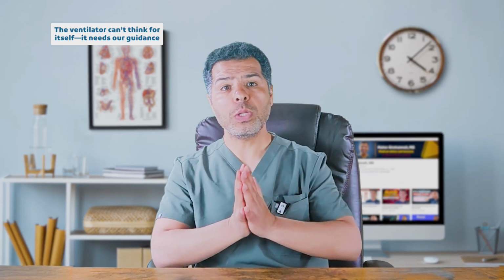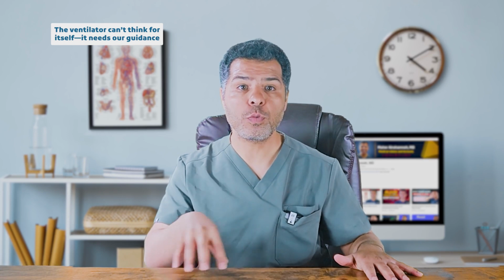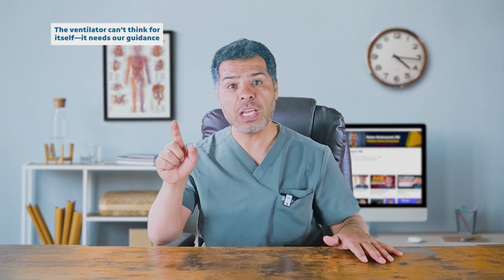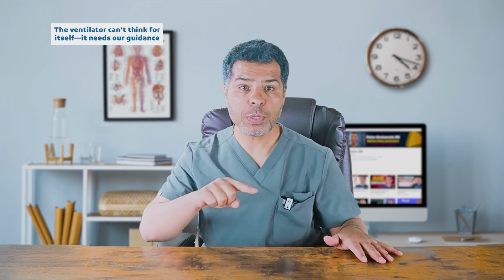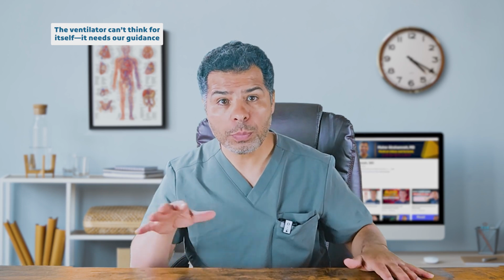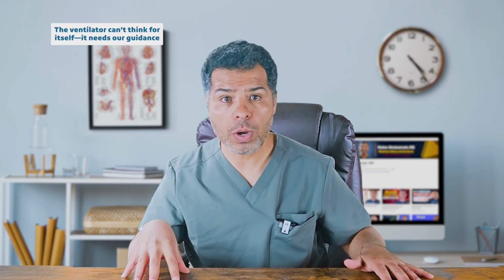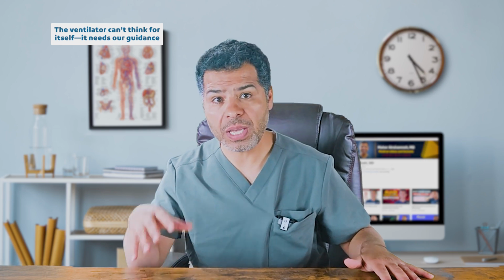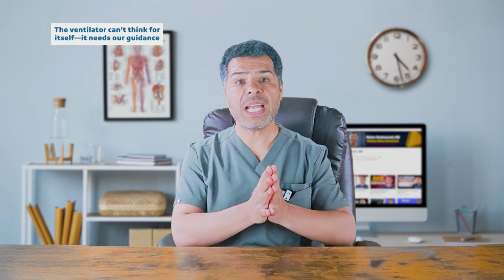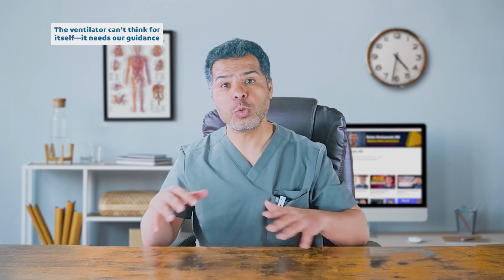Now, what do you think will happen to the PIP if we set Vmax at 70 instead of 44? If we increase the Vmax to 70 instead of 44 in flow target ventilation, the peak inspiratory pressure will increase. That's because in flow target modes, pressure and flow are directly related. A higher set flow requires more pressure to deliver the breath, as we mentioned in the equation, resulting in a higher PIP. On the other hand, setting a lower flow would reduce the pressure needed, leading to a lower PIP.